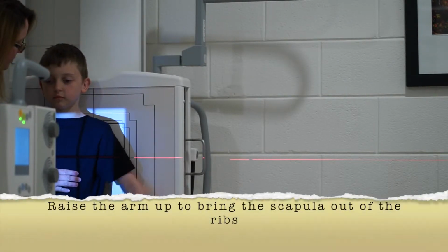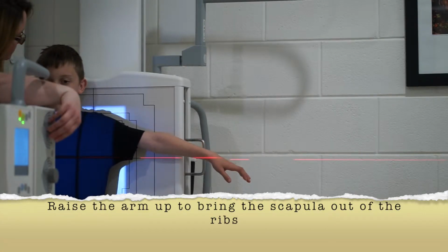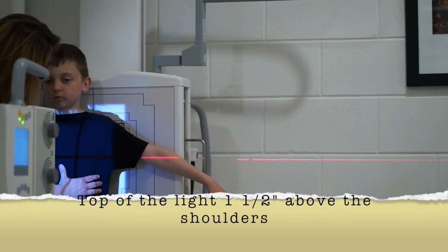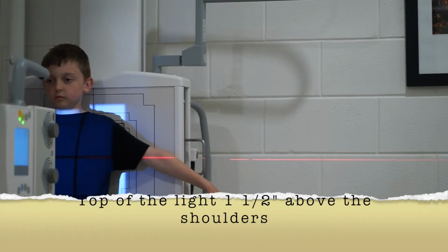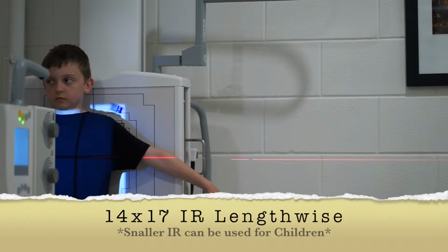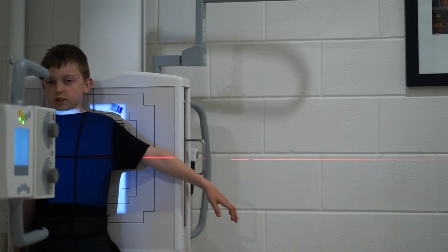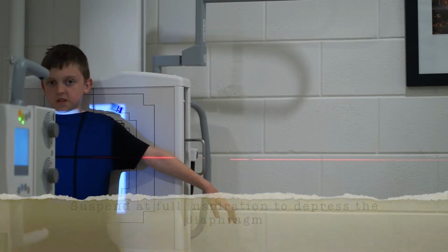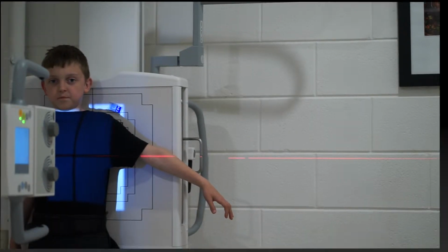Can you hold your arm out? Okay, when I step away, I want you to take in a deep breath, okay? Take in a really deep breath and hold it.